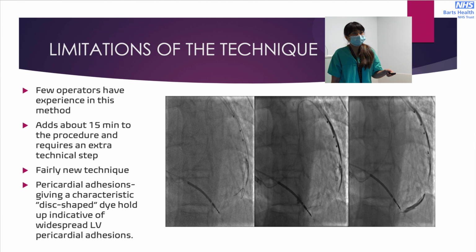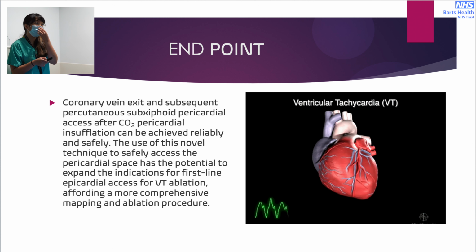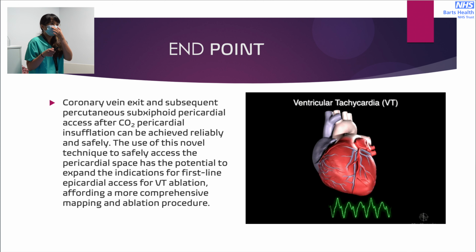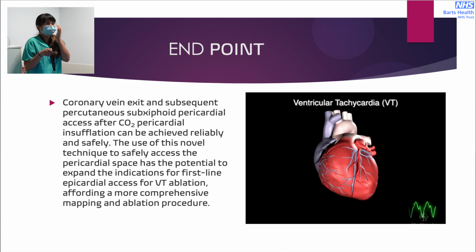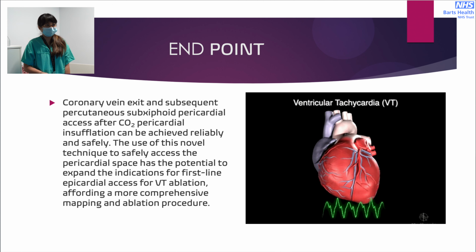I've encountered this case before, and we abandoned the case. The patient had a previous failed epicardial puncture already. So the endpoint for this is that coronary vein exit and subsequent percutaneous subxiphoid pericardial access after CO2 insufflation can be achieved reliably and safely.